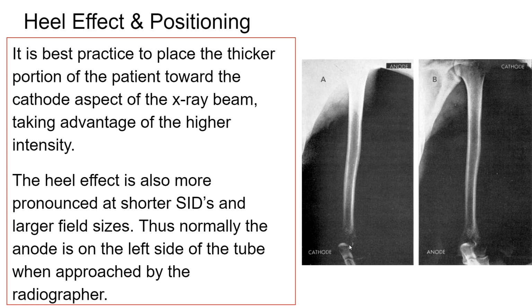So in theory, you should put the elbow at the anode side where you're getting less radiation so that you can now see it better. And at the same time, towards the humeral head, which is a thicker object, it is towards the cathode side now, right? Because if anode is down here on the right side, then cathode is up here. Well, it even says that, right? Now you're getting a more uniform density. You're better penetrating the head of the humerus.